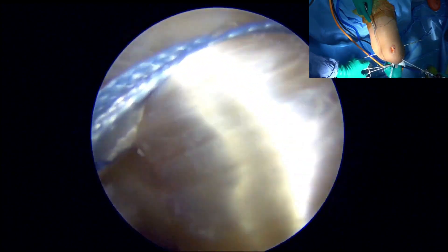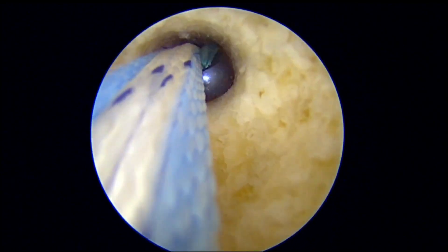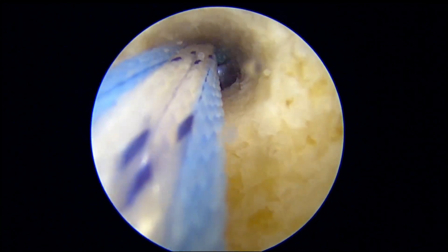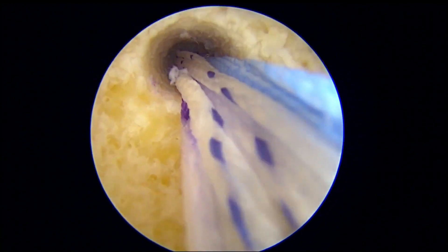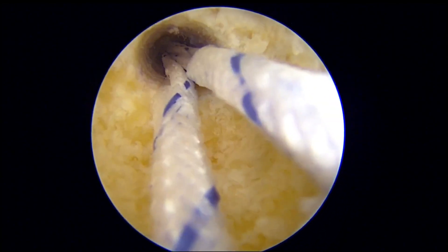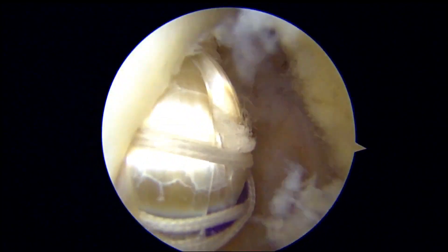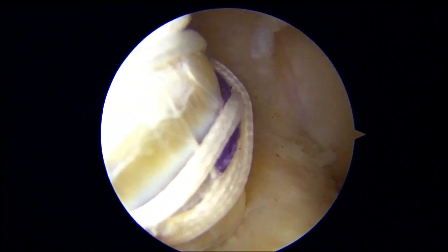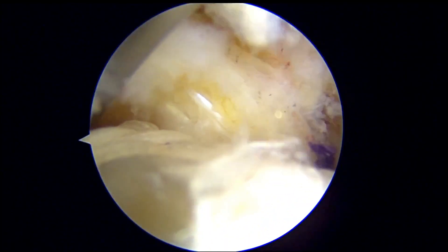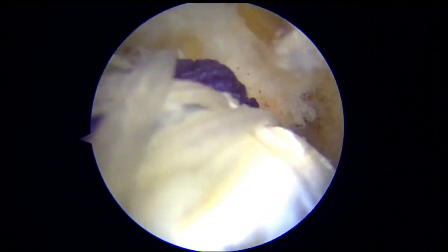Next, the graft is passed into the femoral tunnel. We perform direct visualization of the button exiting the femoral cortex and then flip it. This direct visualization helps prevent the button from being pulled out too far into the soft tissue if pulled too hard. The adjustable suture on the femoral side is then pulled to draw the graft in. Before the entire tunnel is filled, the wire guiding the interference screw is inserted. We add a screw to the femoral side of our PCL reconstruction, because this is the weakest point of the graft. At this point, there is acute angle tension from the straight femoral tunnel as the graft bends posteriorly.